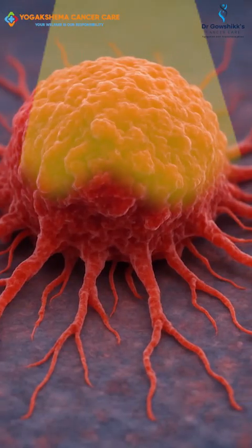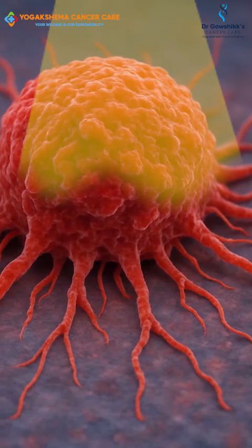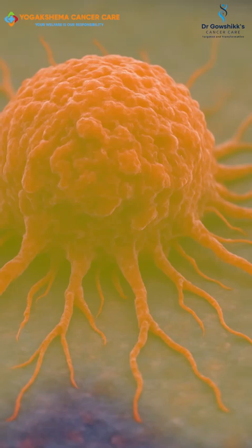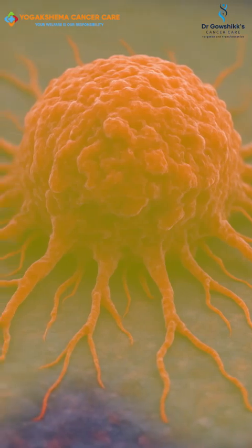So the tumor will also get the radiation. The surrounding structures, say it's the bladder or the rectum, any critical structure which is around, is also going to get the radiation. So even though the tumor is going to get treated, the surrounding area will get the same amount of radiation that the tumor gets, and it might go into permanent dysfunctions.